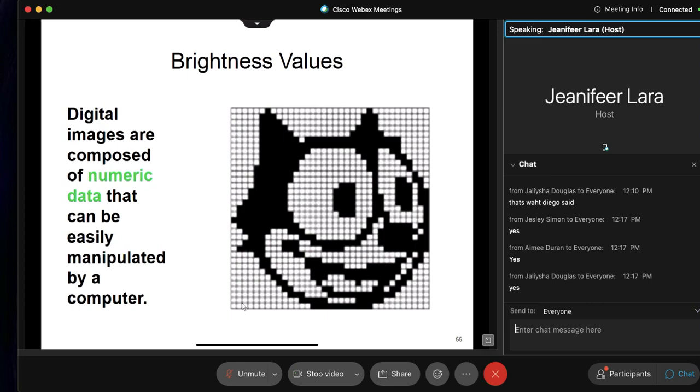A pixel is each little box inside of the matrix. It's like saying, how many pixels do you have in your family matrix? How many members belong to your family matrix? Make sense? So matrix here, or image matrix, or image receptor matrix, is rows and columns of pixels, a picture element, pixel.